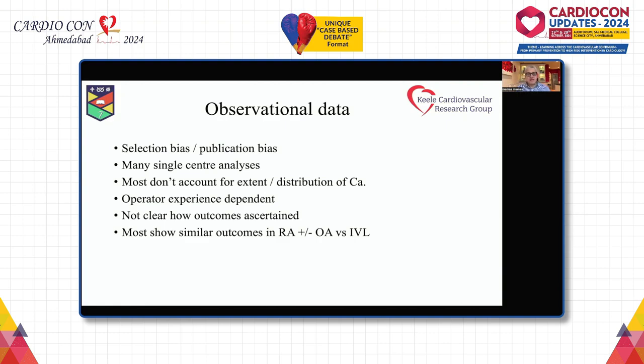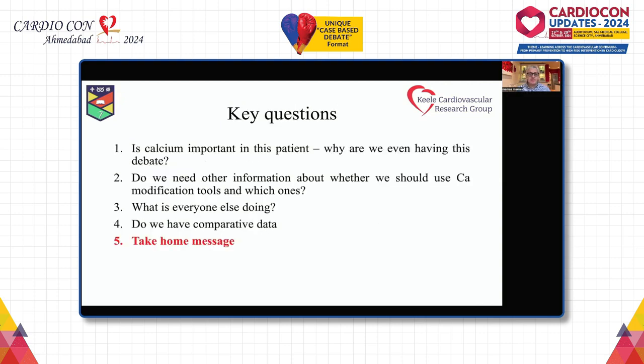I also think that many of these observational series depend on operator experience. And as I've shown before, a low-volume operator using rotablation or orbital atherectomy is going to have very different outcomes to a high-volume operator, although this is not present when using IVL. And it's also not really clear how many of these outcomes were ascertained. I think the vast majority of observational studies from good groups have shown very similar outcomes in comparisons of rotational or orbital atherectomy versus IVL.